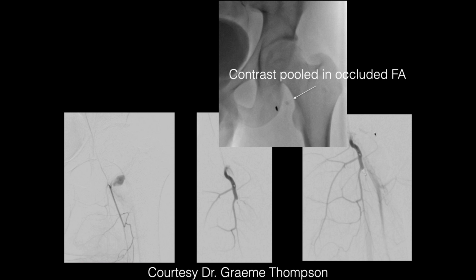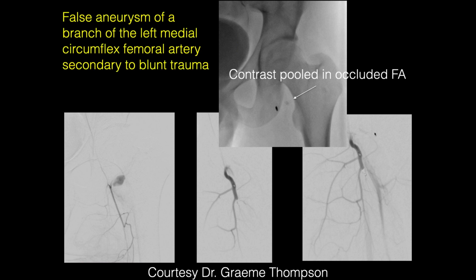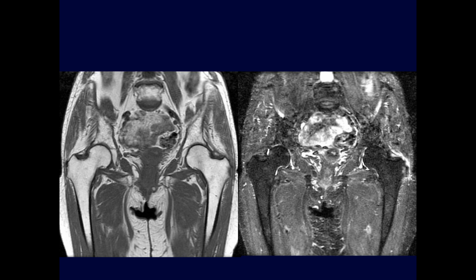And did they coil it? It doesn't look like it, so they have an occluded artery there. So we can see that location. So this patient had a big vascular lesion right where they had that hematoma. Good. I don't think anything is to be done for that other than tie it off if you have to. That's probably what I would recommend if I was the surgeon.